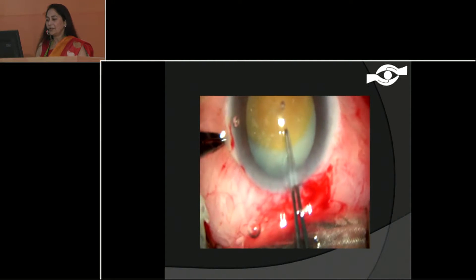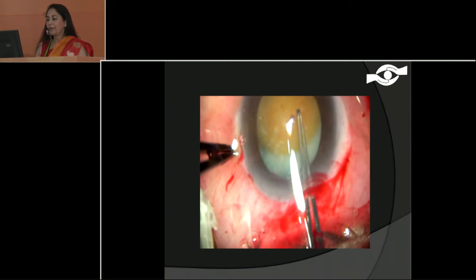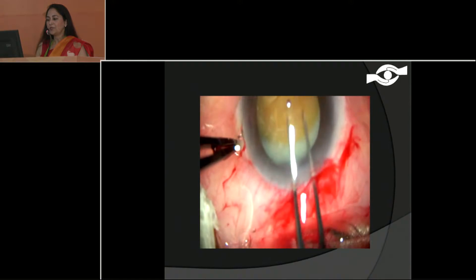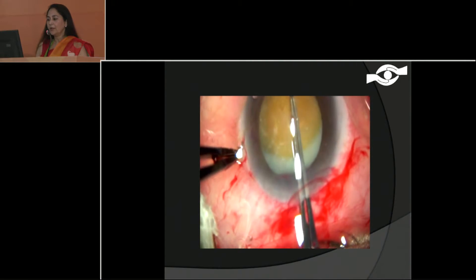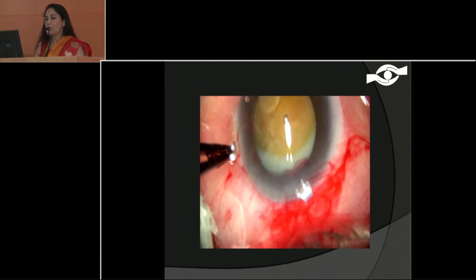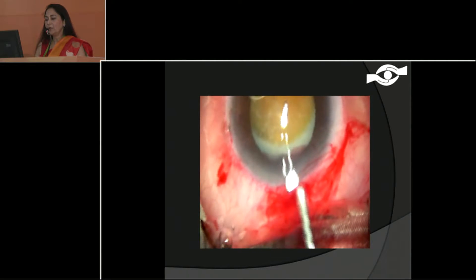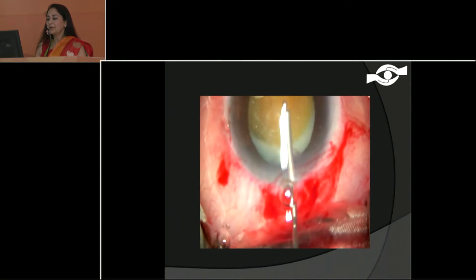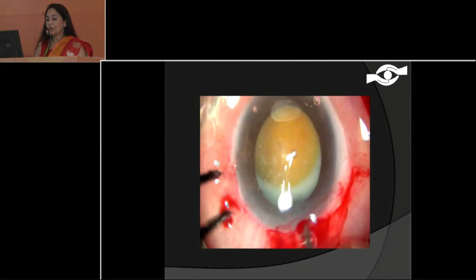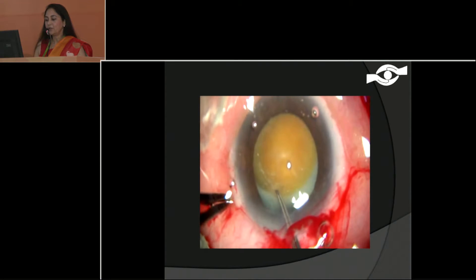This case I just did yesterday — you can see it is a very difficult case. It is a Morgagnian cataract and it has also got a little bit of fibrosis on the capsule. At the center, hold it and keep the margin of the pupil as your guide, moving very slowly without disrupting. You can see there is a lot of fluid cortical matter inside but still there is no disruption and you don't see it leaking out. Very gently hold — it's already folded in that area, so you come back.